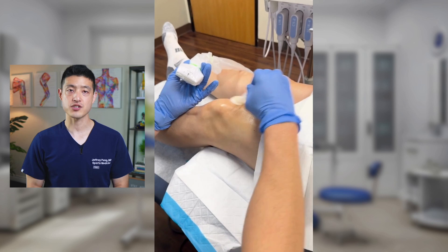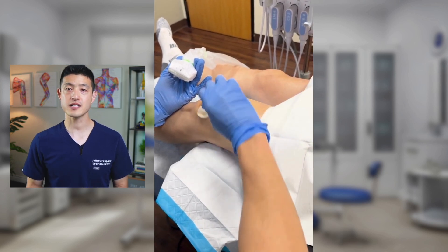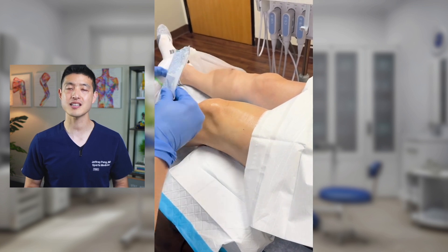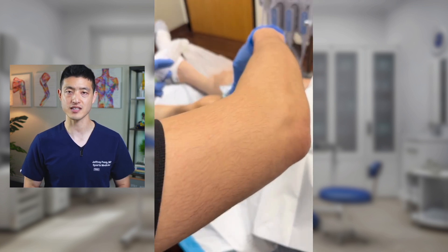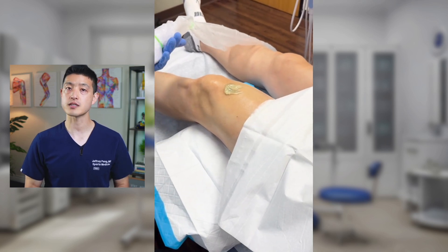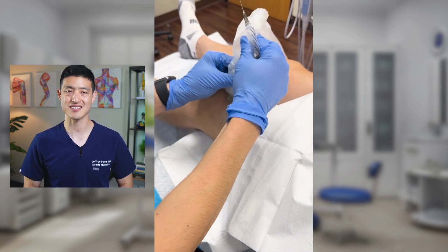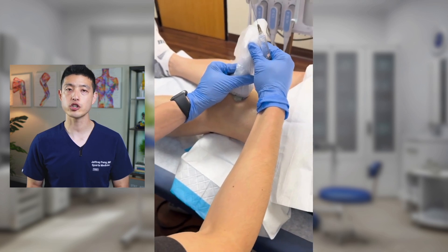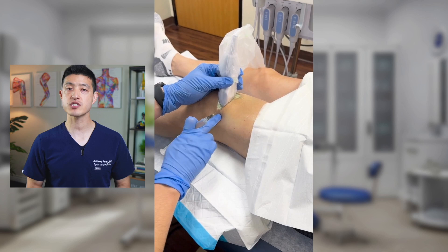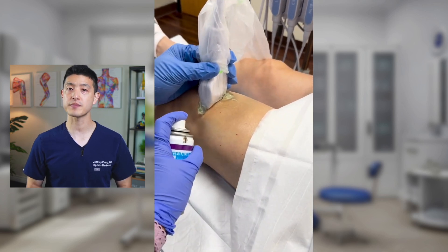Here's the same patient, but the other knee. The first thing you see me doing is just cleaning the skin. I like to use chloroprep, which is just an antiseptic solution to disinfect the skin. The next thing we do is put a little bit of ultrasound gel on the top of the knee so that I can see inside — I want to make sure we get a good image of the knee joint. Again, I tell my assistant where to spray the ethyl chloride to numb up the skin.